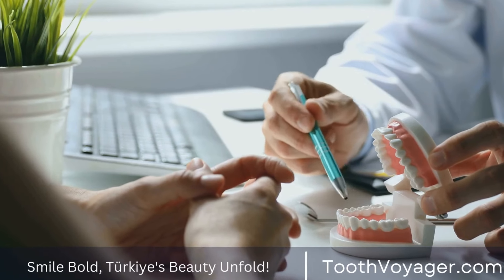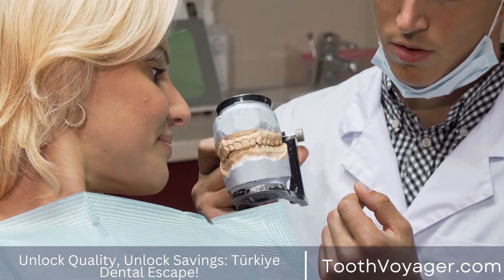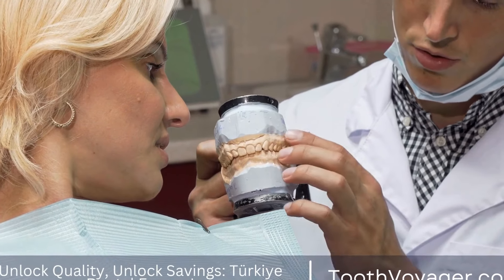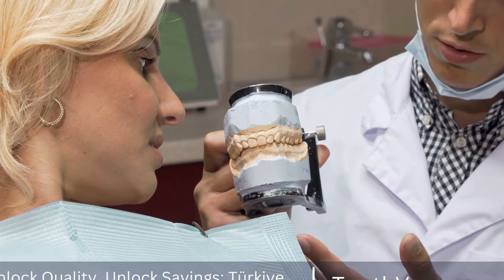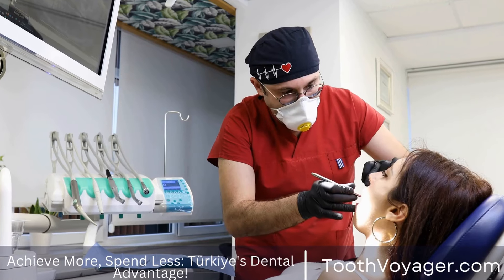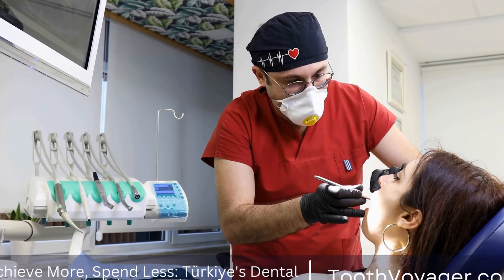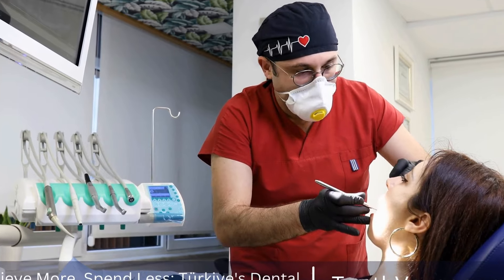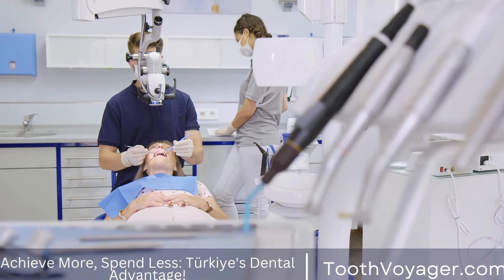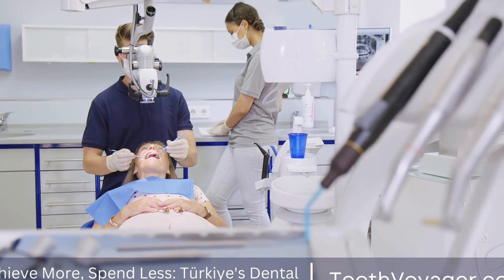Step 5: Filling the Canals. Once the root canals are cleaned and shaped, they are then lined with a biocompatible substance known as gutta percha. This material is used to seal the root canals, preventing bacteria from entering again and causing infections. The tooth is then filled with a temporary seal to safeguard it until a permanent restoration is placed.